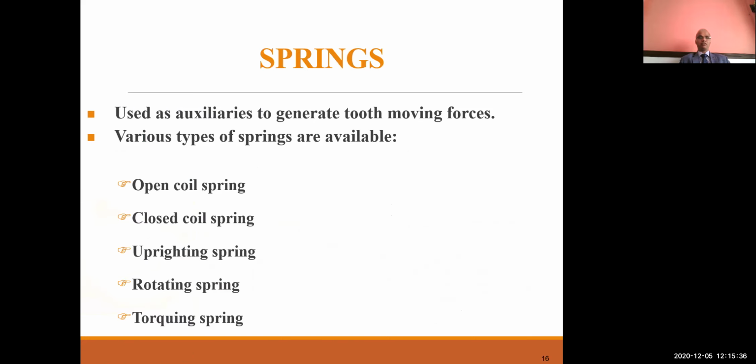The springs are auxiliaries which are used to generate tooth moving force. Varying types of springs are available. It may be open coil spring, closed coil spring, uprighting springs, rotating springs, and torquing springs.